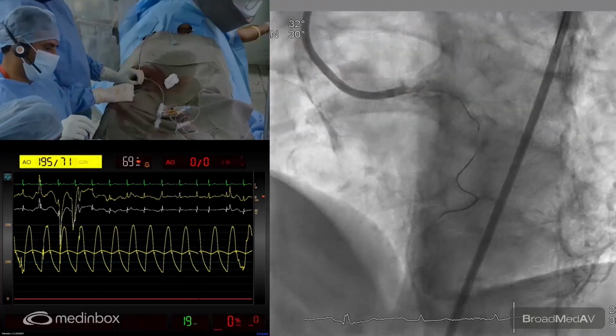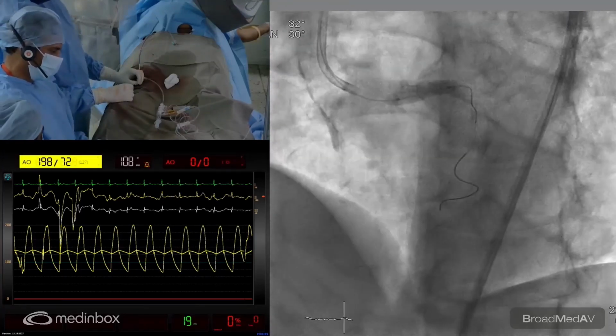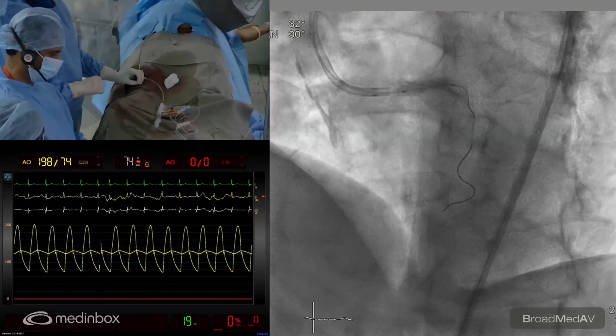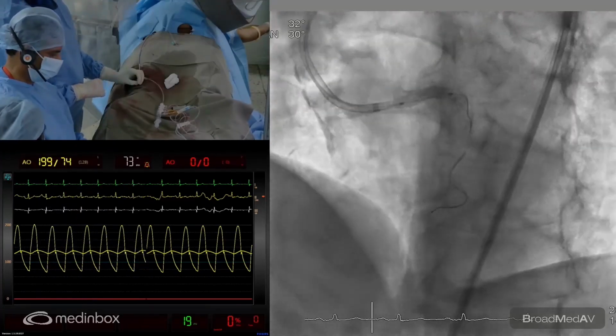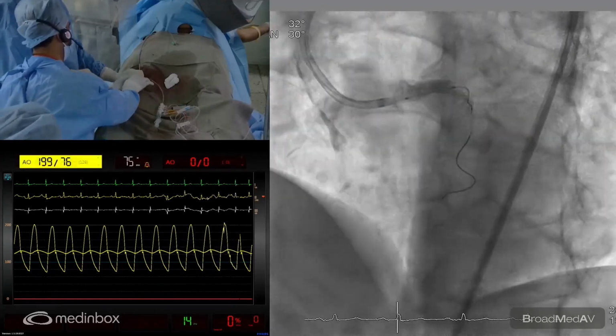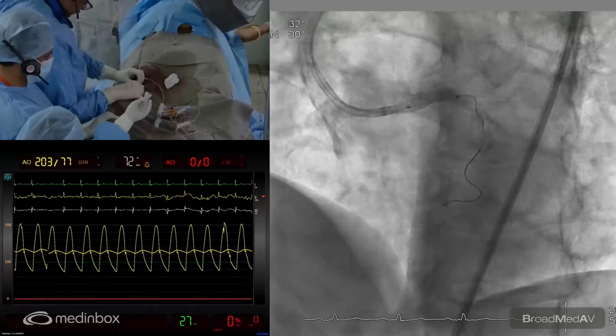Show me the deployment of the stent, Cine, please. It looks reasonably up, it doesn't look as if it's underdone, but obviously the left main ostium is a very strong area. You can get elastic recoil, so we'll need to push it up as much as possible.